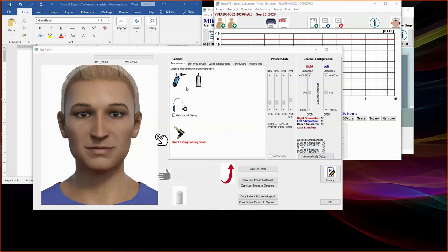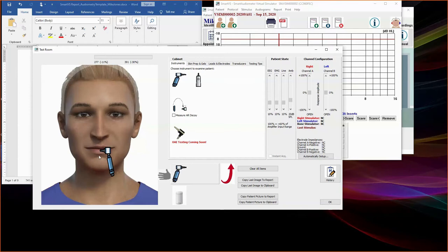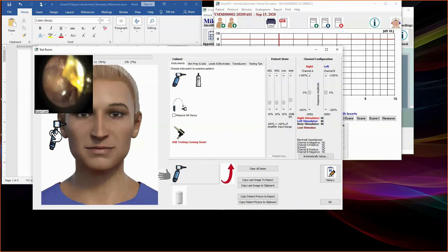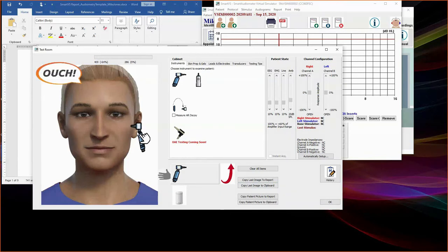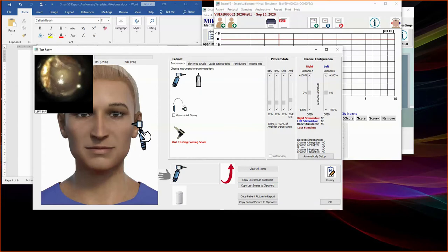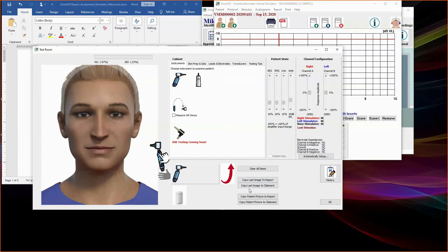To begin the otoscope examination, select your otoscope instrument from the Instruments tab by left-clicking on it. This will place the instrument in this location, active for testing. Now you can move the instrument over to your avatar and place it in the ear canal. Press down with your left mouse click in order to view the ear canal. Select copy last image to clipboard and use your paste function to transfer the image over to your report as necessary. Move the instrument over to the opposite ear. If it is placed incorrectly, you will see the ouch message. Otherwise, you will see the image of the left ear canal. Select copy last image to clipboard and transfer that over to your report. To return the instrument back to your testing cabinet, use the red up arrow.